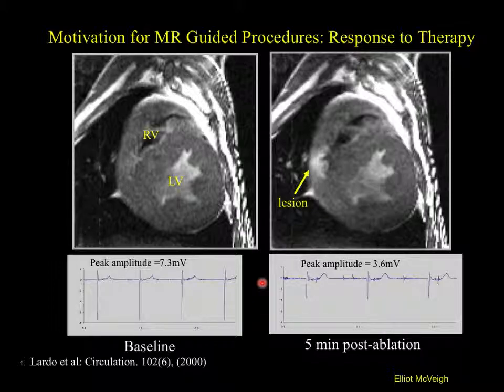And the rest is fairly simple. You just put an ROI on the myocardium, you measure the signal as a function of time, and you fit that to a model that gives you the amount of perfusion in it. So it's pretty simple. Some advanced stuff I wanted to show you is MR imaging during lesion ablation. And so this is left ventricle of a pig, I think, or a dog, one of the two. And there's an RF ablation catheter here in the crux of the right ventricle.